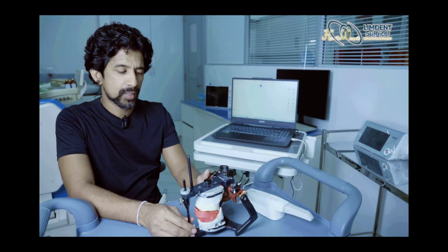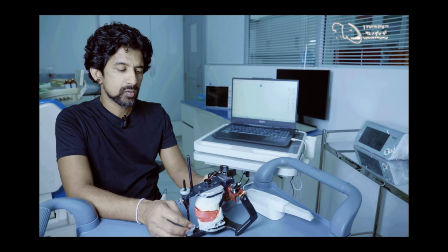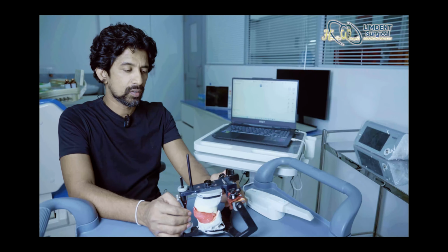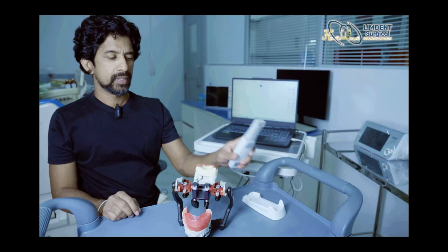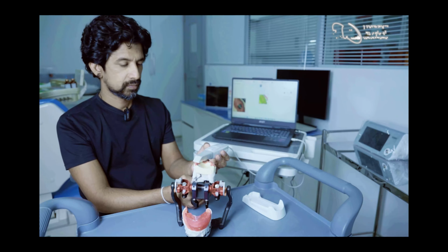So the first step of this procedure will be to scan the upper and lower arches of the patient. In that case, all the things are fixed. Open up the articulator. So we'll be scanning. You can remove the incisal rod of the articulator. We'll be scanning the upper impression this way.